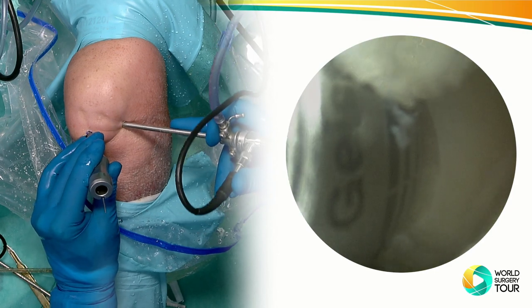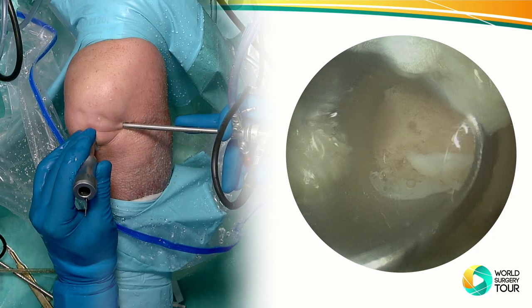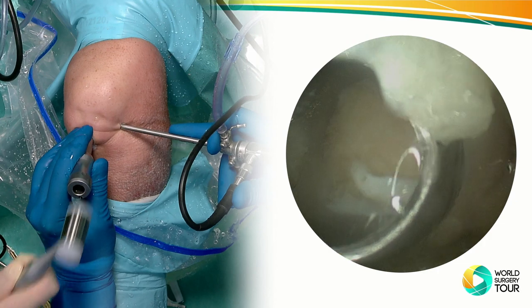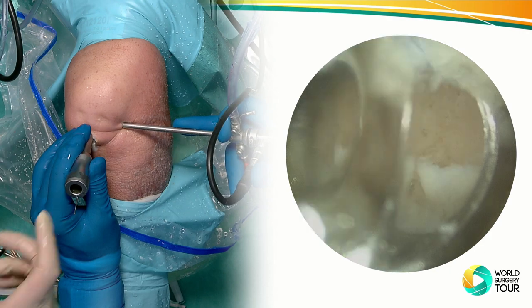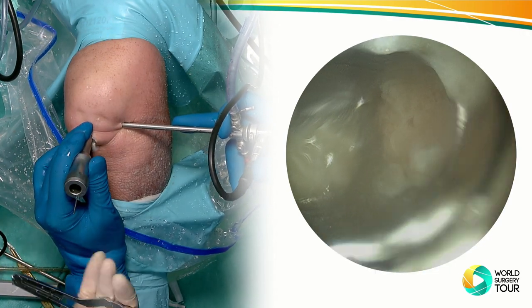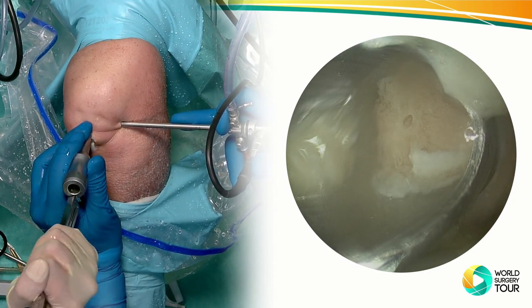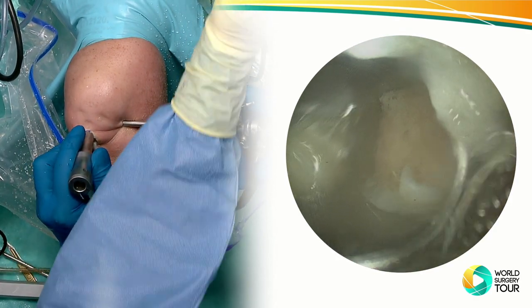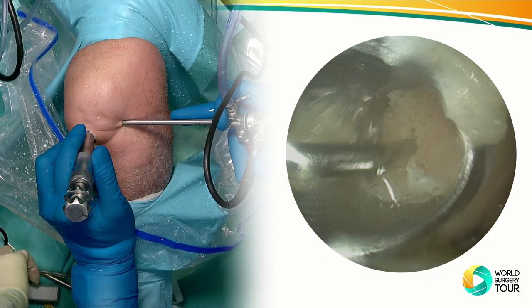Of the surgery, you're just going to continue now doing this one. So now, whoops, it's in, perfect. Just put in the... Okay. Bang it in a little bit. Mm-hmm. Okay, do you want the centralizer again? You need to remove the other one. Okay. Thank you. Or bend it. Here we go. Okay. Bang it in.